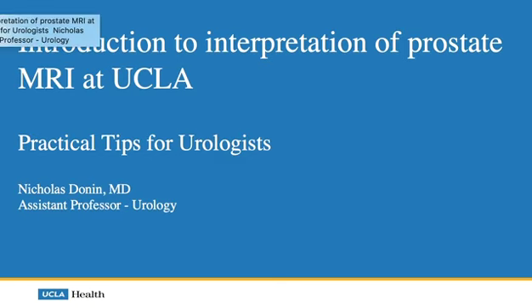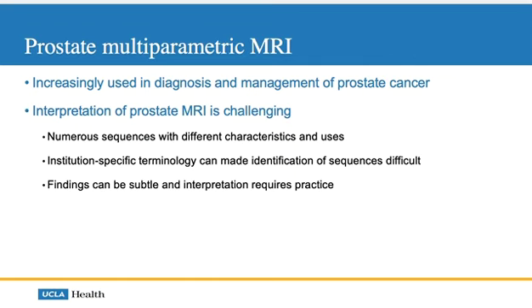Introduction to Interpretation of Prostate MRI at UCLA. Practical tips for urologists and urology residents. Prostate multiparametric MRI is increasingly used in the diagnosis and management of prostate cancer.